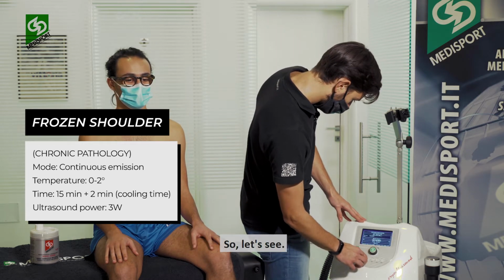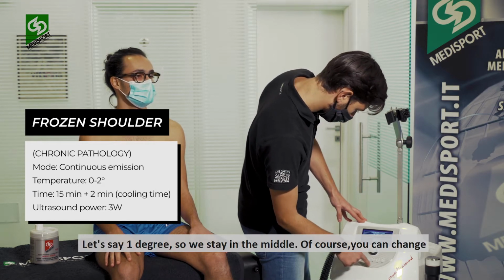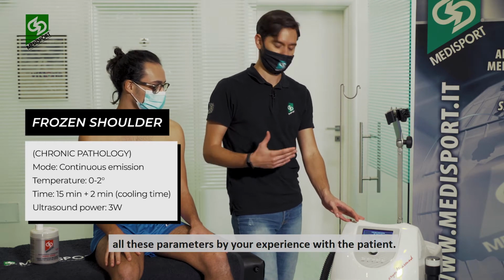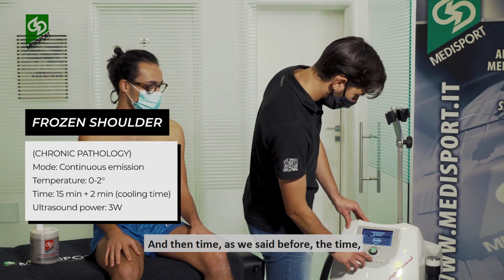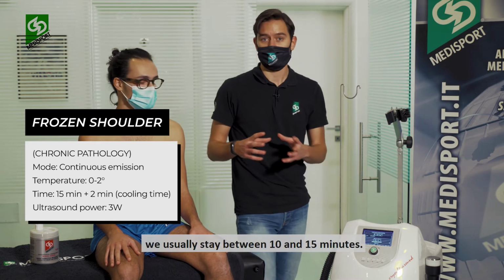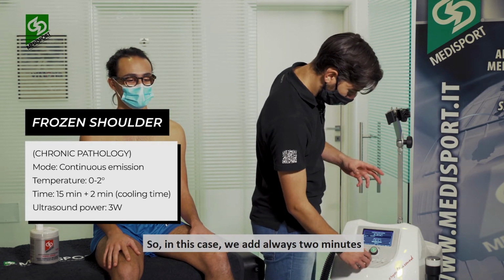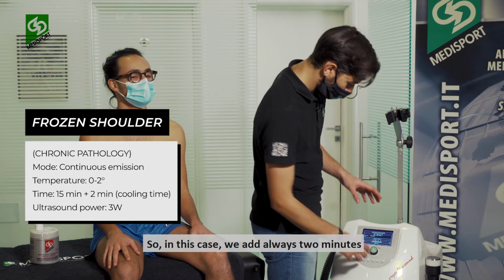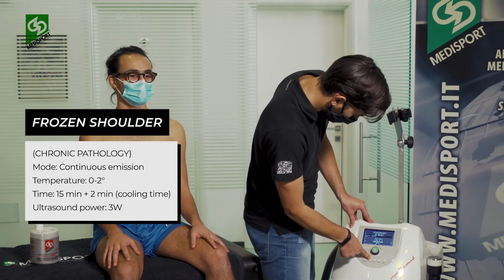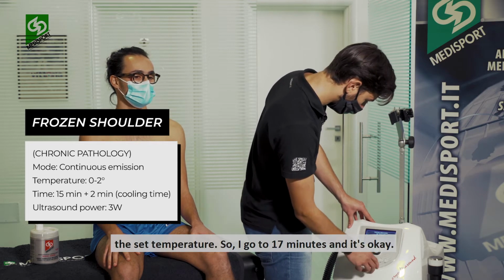So let's say 1 degree. So we stay in the middle. Of course, you can change all these parameters by your experience with the patient. And then time, as we said before, we usually stay between 10 and 15 minutes. In this case, we always add 2 minutes to allow the device to reach the set temperature. So I go to 17 minutes, and it's okay.